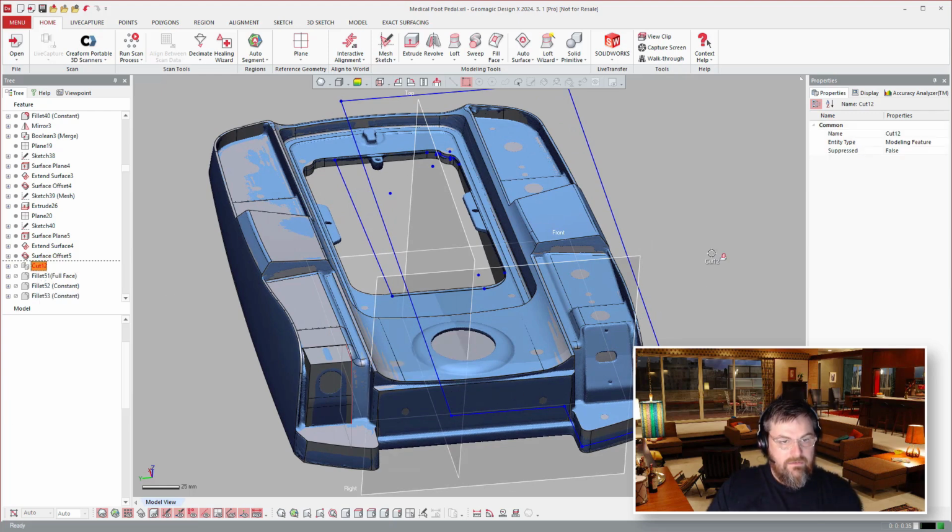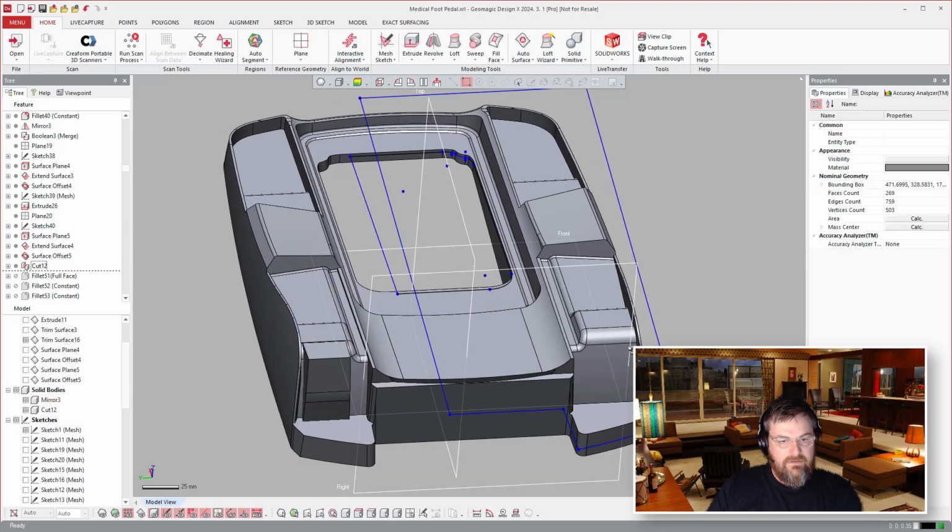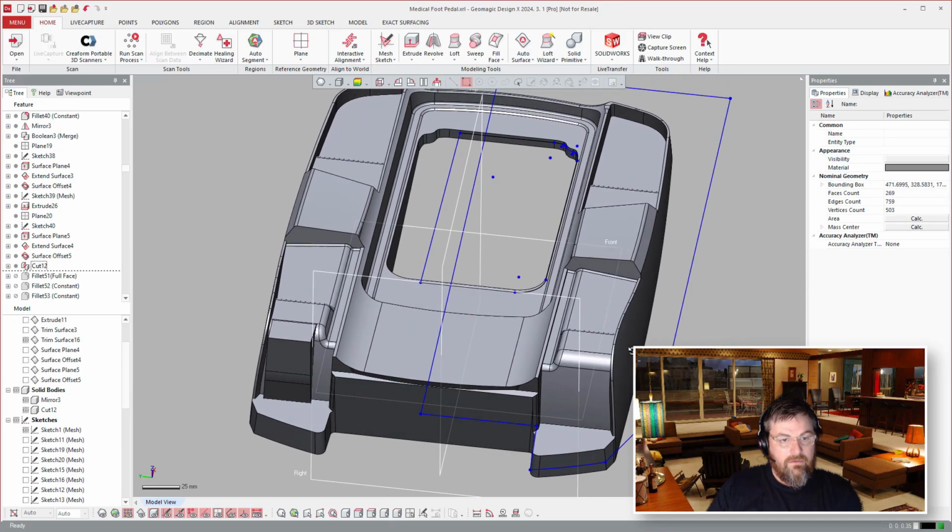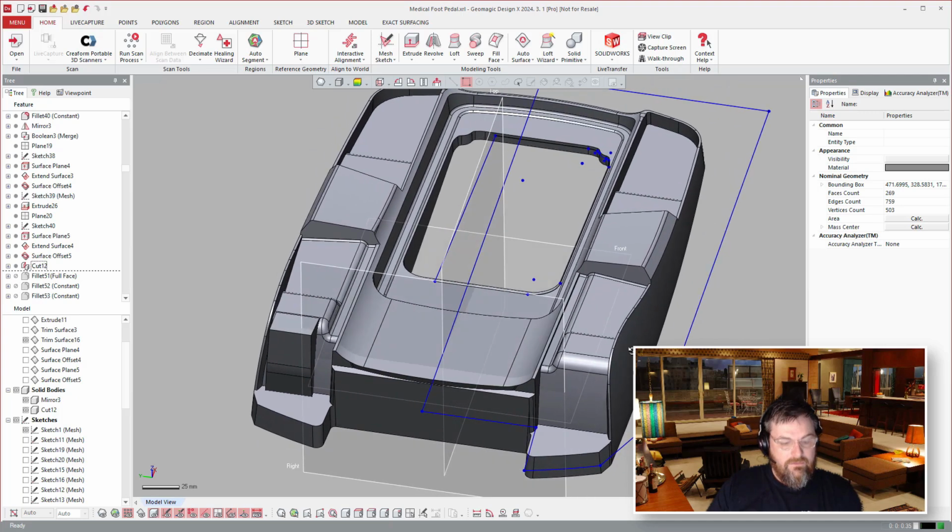So let's just turn this off so you can see, because the majority of the part is symmetrical, but then there are some varieties of differences. So once you get to a certain stage where you're going to add some of these distinct features, it makes sense to go ahead and mirror it now and add those distinct features. So you can see here, you got these guys here.